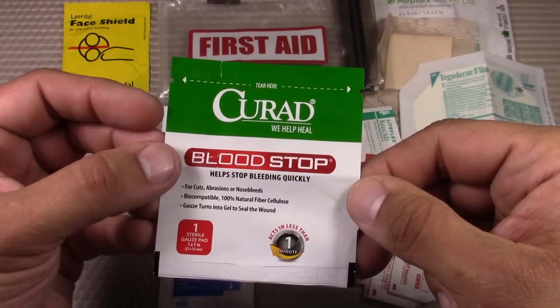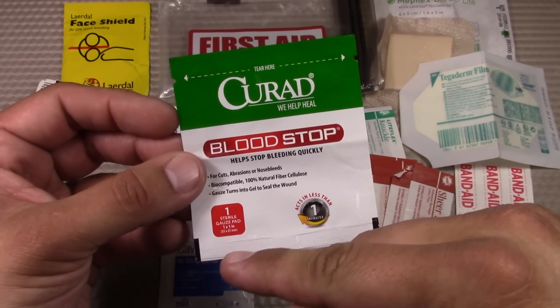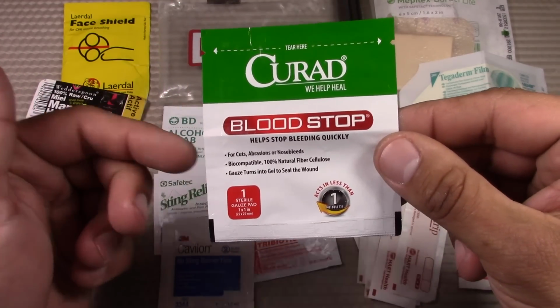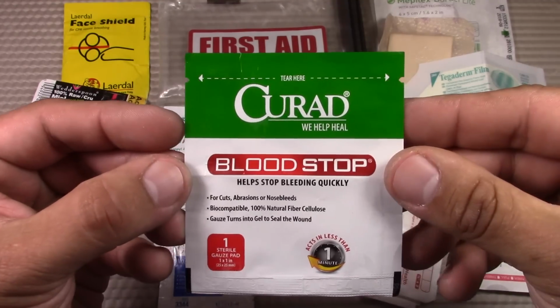This is non-irritating biocompatible gauze, and the gauze, when it comes into contact with blood, it turns into a gel-like substance, and it acts in less than a minute. So we're talking for cuts, abrasions, nosebleeds, and this is just for stopping blood, so Curad.